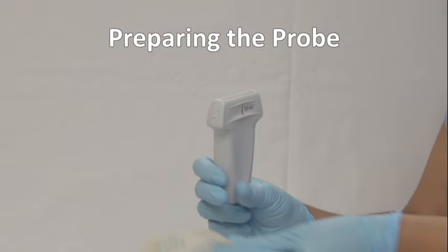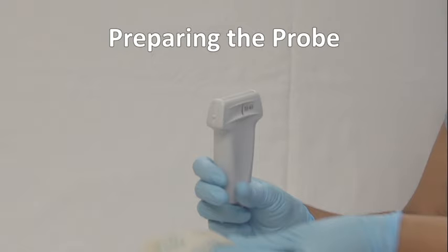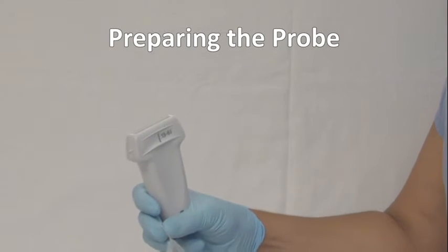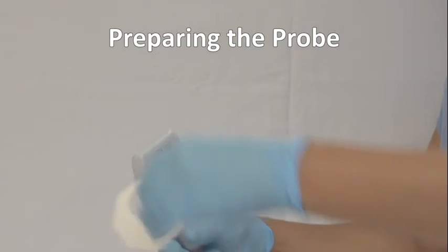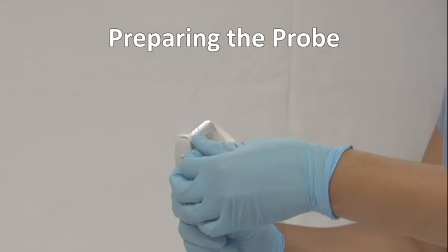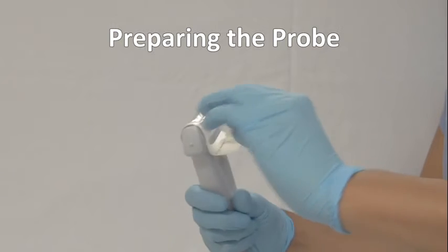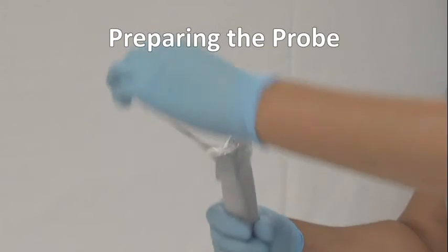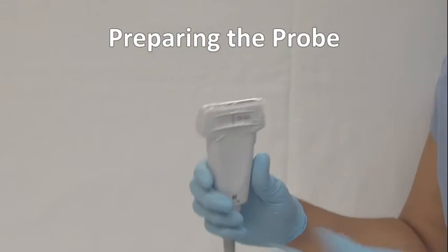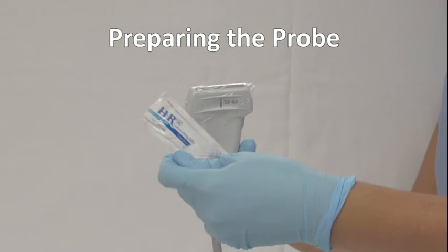The linear or high-frequency probe should be used for venous access to have a high-resolution image of superficial structures. A Tegaderm or Opsite may be applied to the probe surface to keep the procedure clean, and sterile gel may be used on the outside of the probe. This is considered a clean, but not completely sterile, procedure.